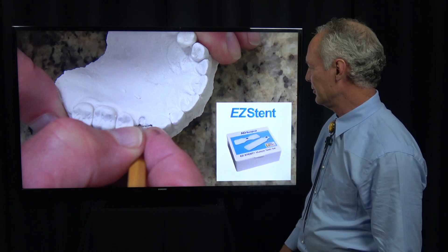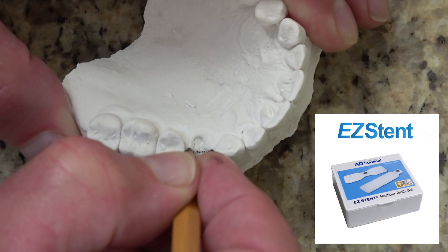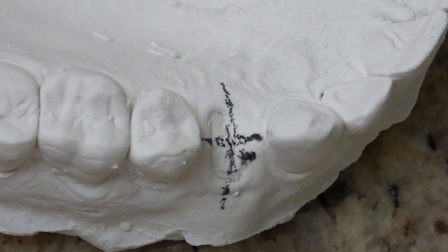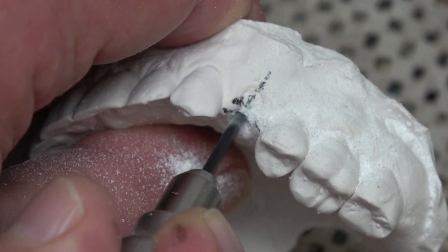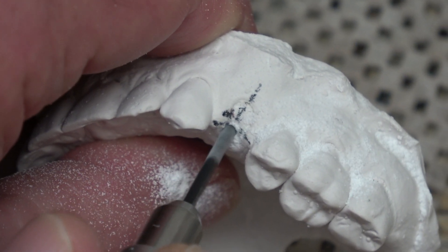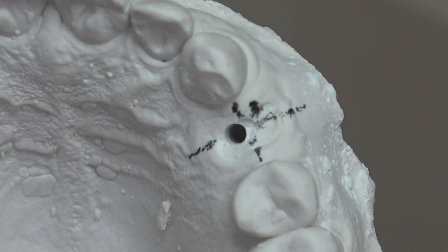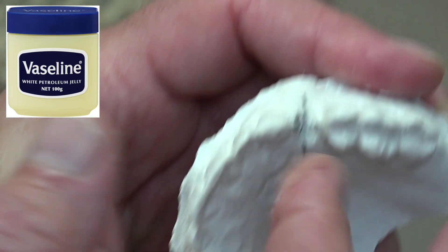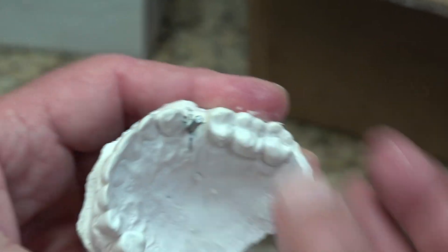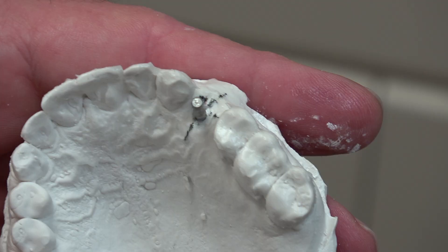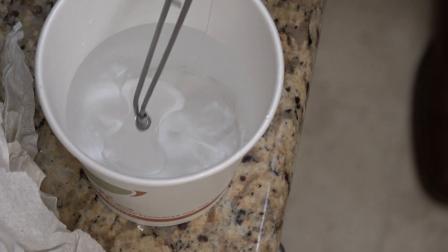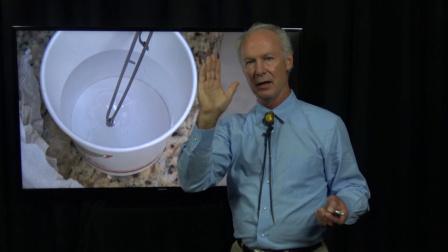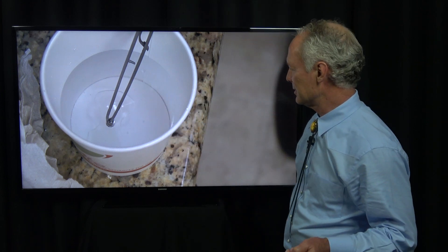The Easy Stent is the surgical guide I've been looking for. They have videos on their site. You mark the center of the socket, then drill parallel to those lines. Then you place this little metal cylinder in there, lined up along the long axis of the adjacent teeth.